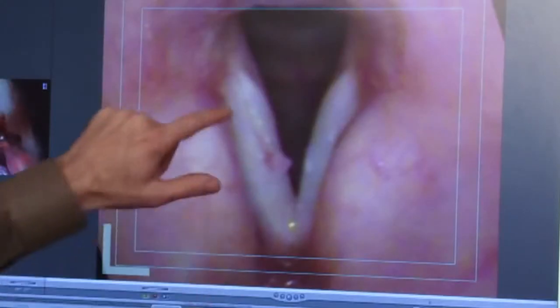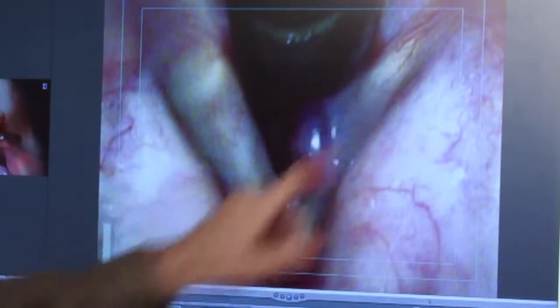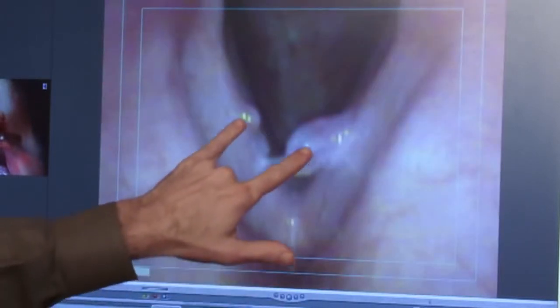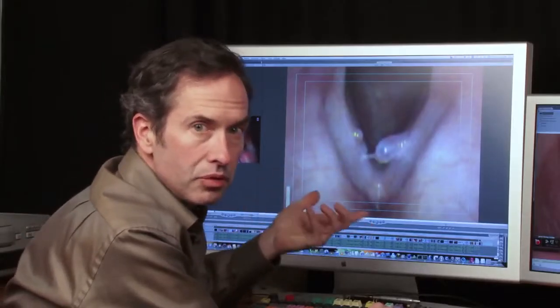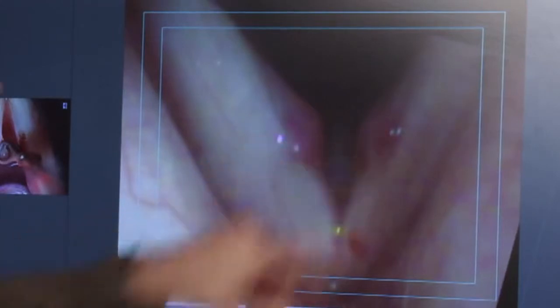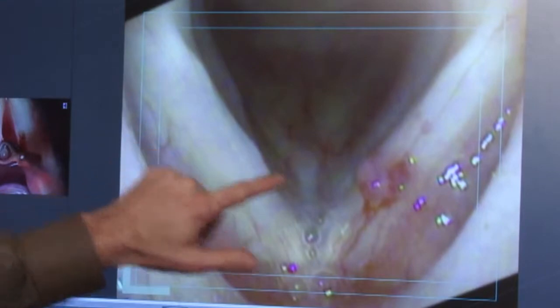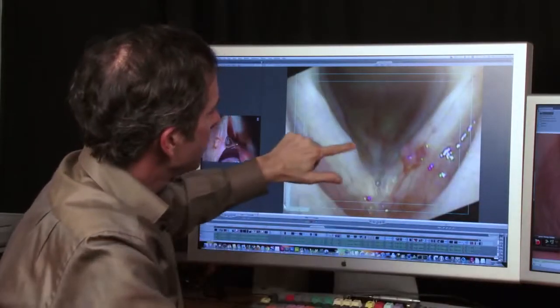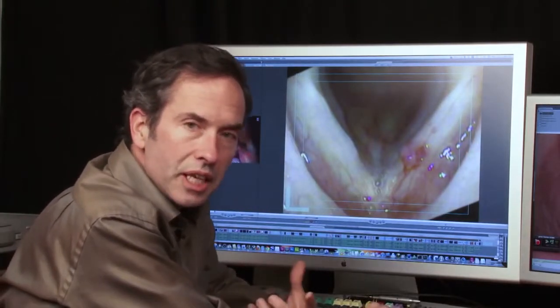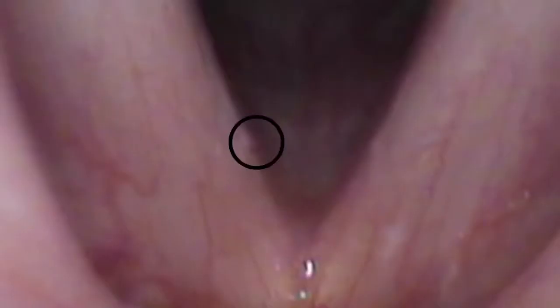A smaller hemorrhagic polyp, but again with a feeding vessel. A very large hemorrhagic polyp, prominent feeding vessels from both sides, multiple polyps. This person has overused their voice acutely a number of times. Again, multiple hemorrhagic polyps. A single one with a reactive thickening on the other side. If you go on speaking with a bump, when the vocal cords come together, it will trigger a reaction or a thickening on the other vocal cord. A very, very tiny hemorrhagic polyp. Many times they're there, you just have to look closely to find them.